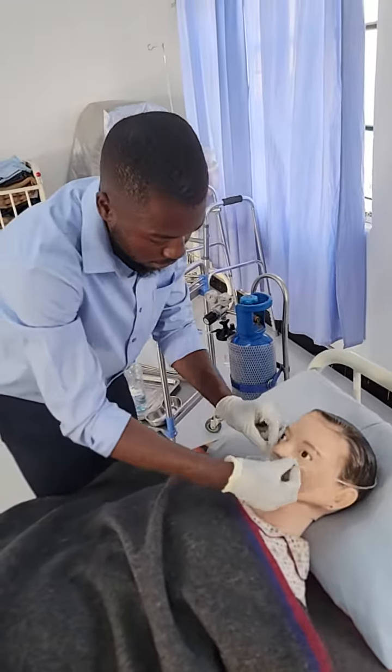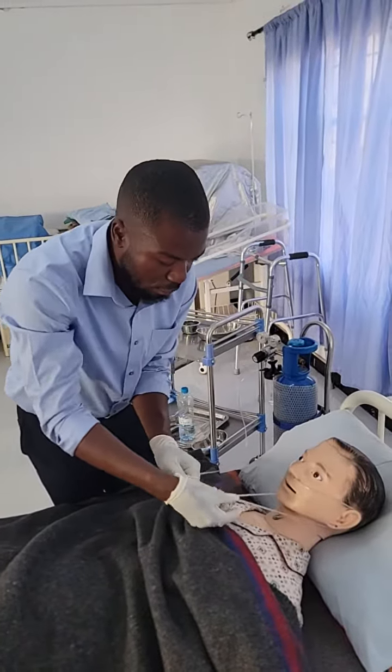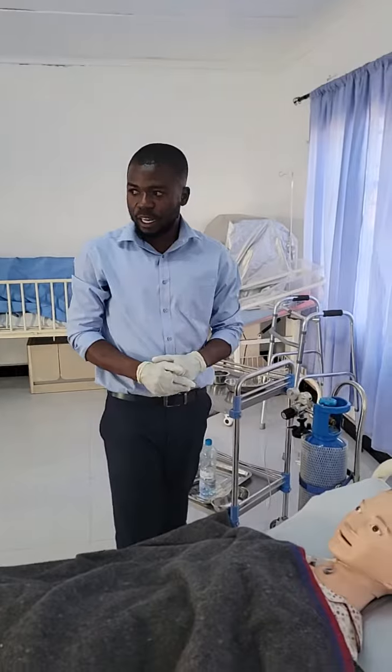You just hold these, place them in the nose, then these will go behind the earlobe, this side and this side. And then you secure it nicely in the neck, like that. Like this, that means we have connected and we have administered the oxygen to the patient or the client.